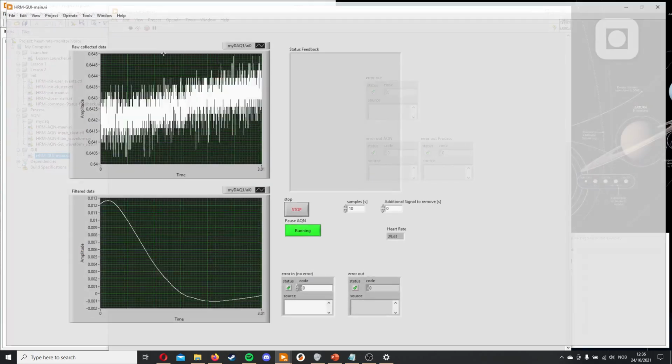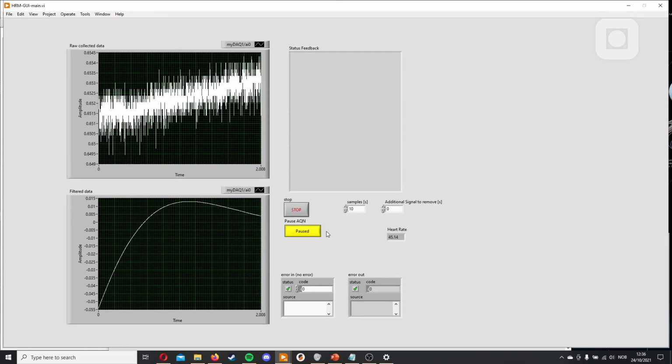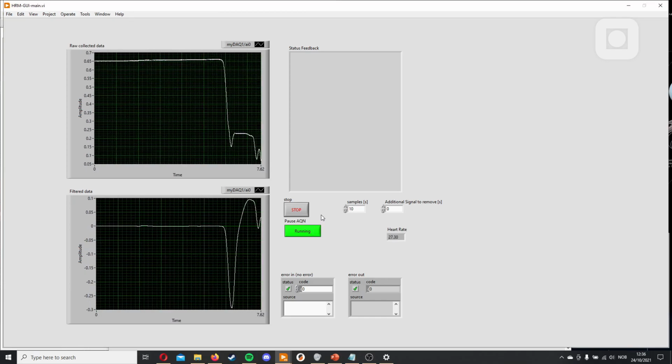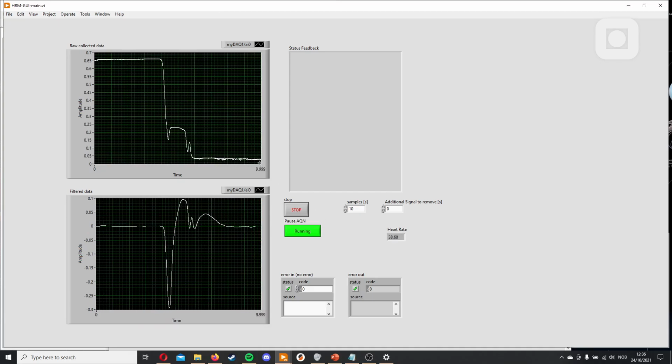Let's try this again. And we see it's running now. We have stopped it or paused it, and it's running. I'll show you when it's useful. When I put my finger here, we'll see soon that it is blocked.